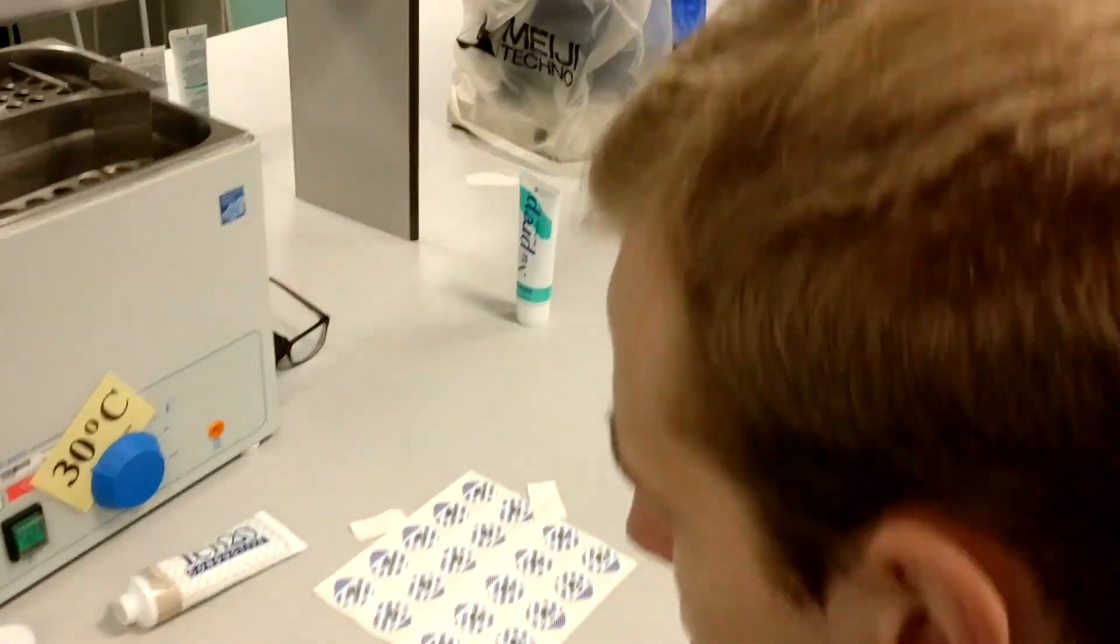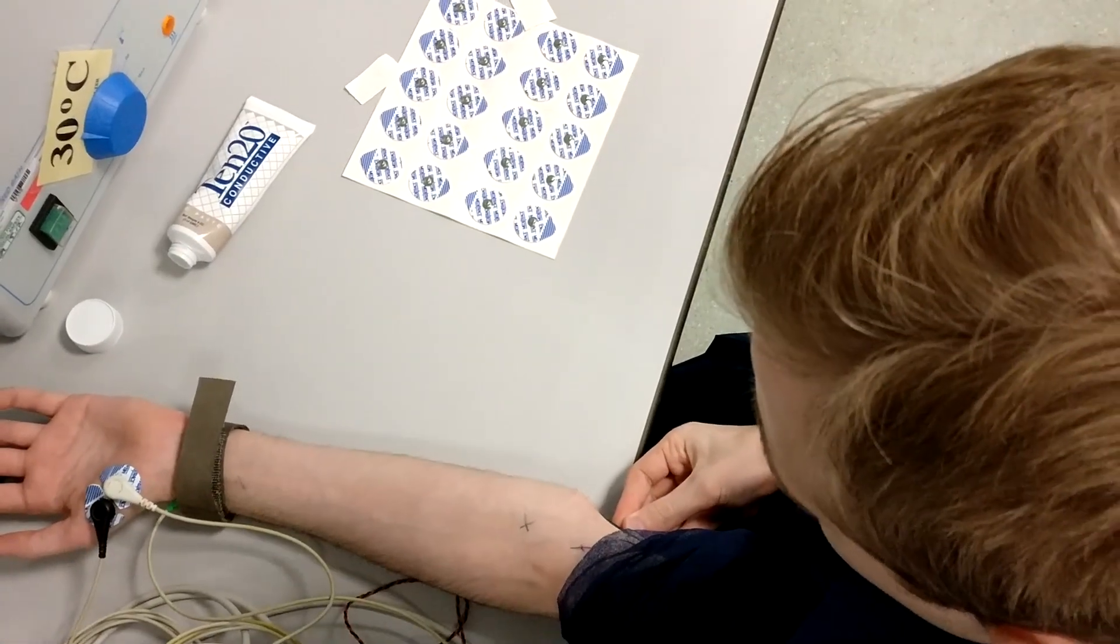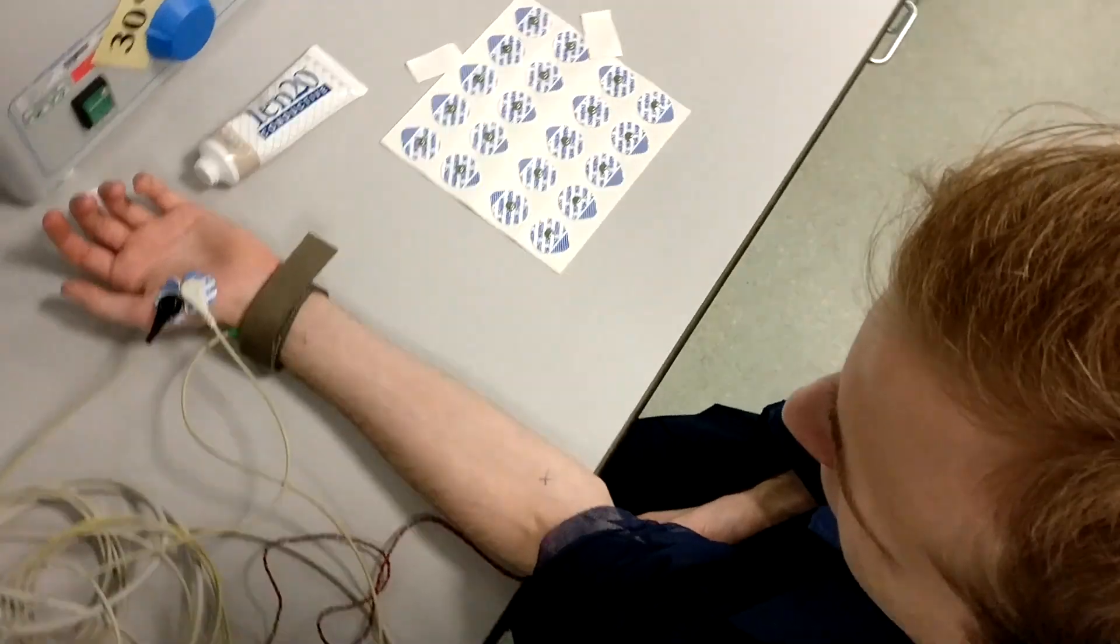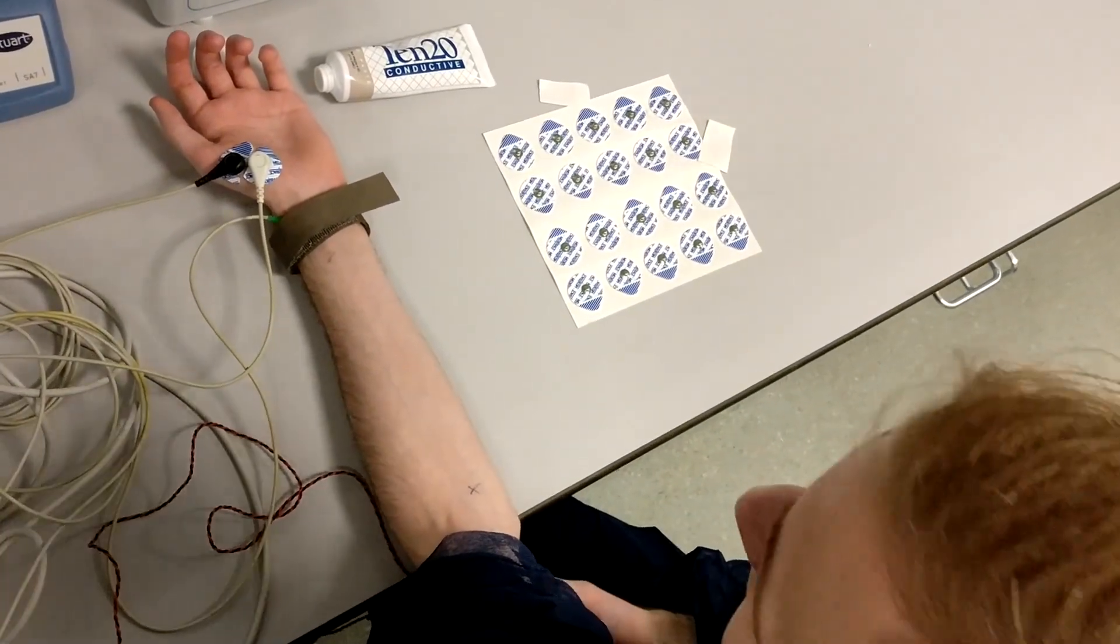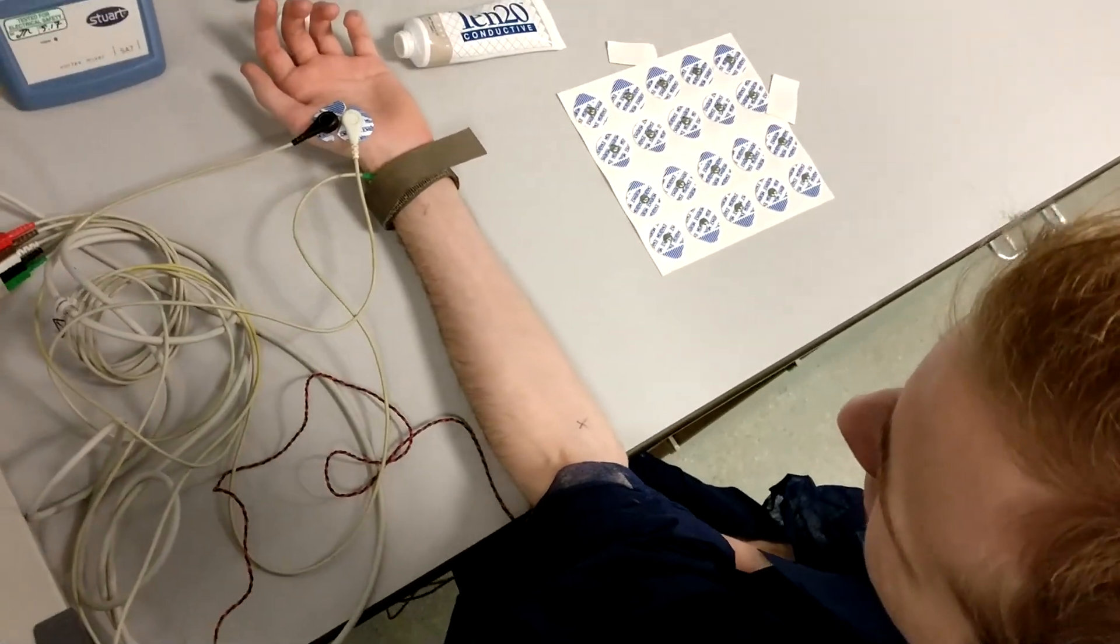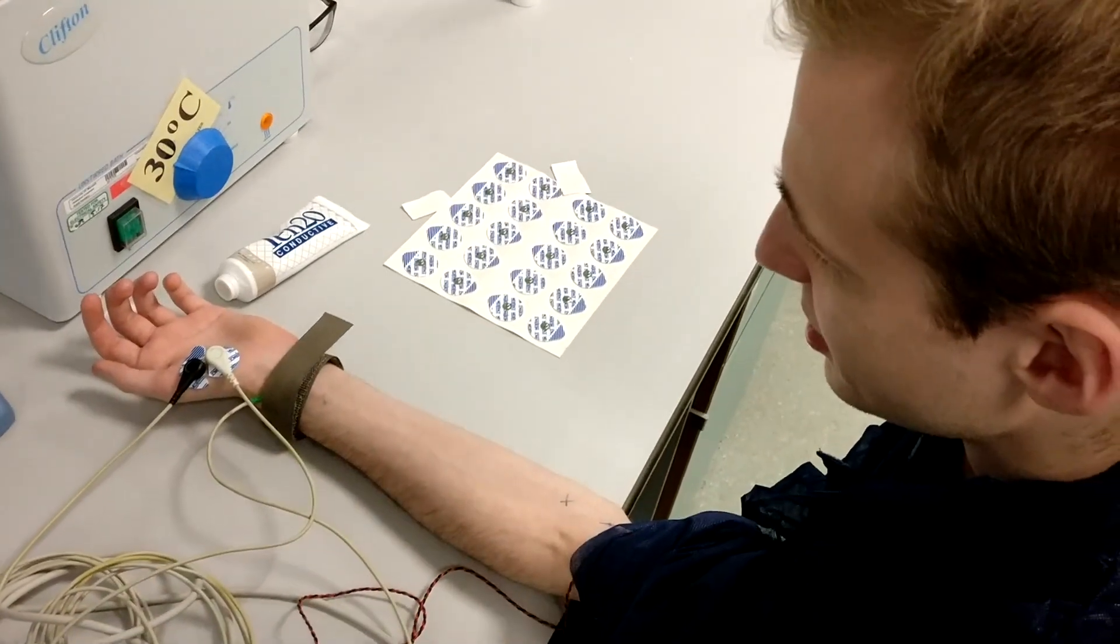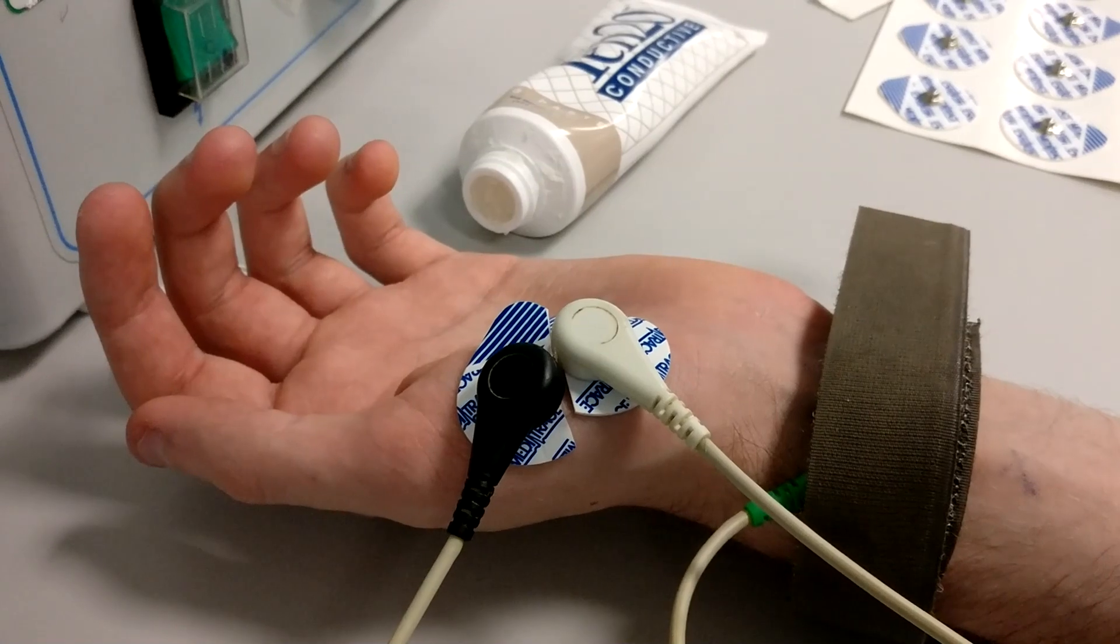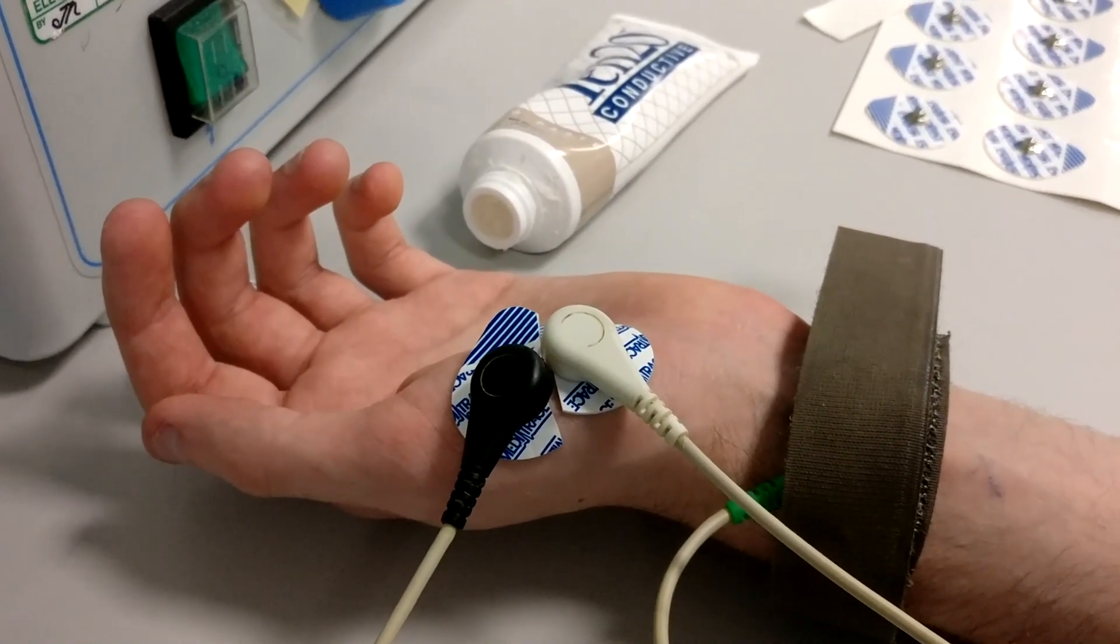This time I think we're going to try my ulnar nerve. Right, there we go. Have a look at that. You can see this is stimulating my ulnar nerve and it's causing my entire wrist to twitch. Getting some quite violent twitching there.